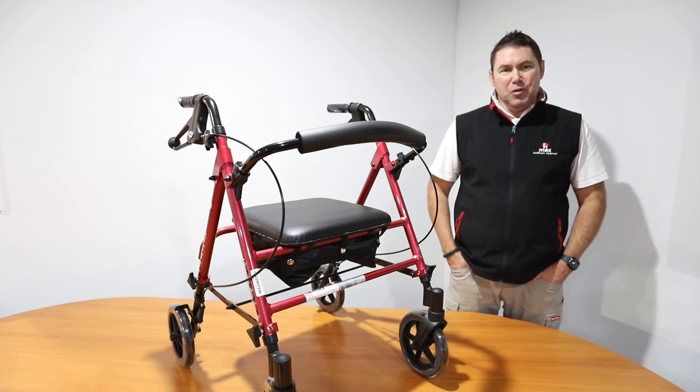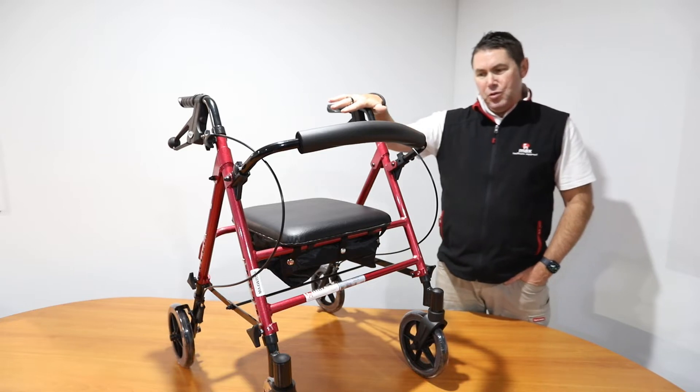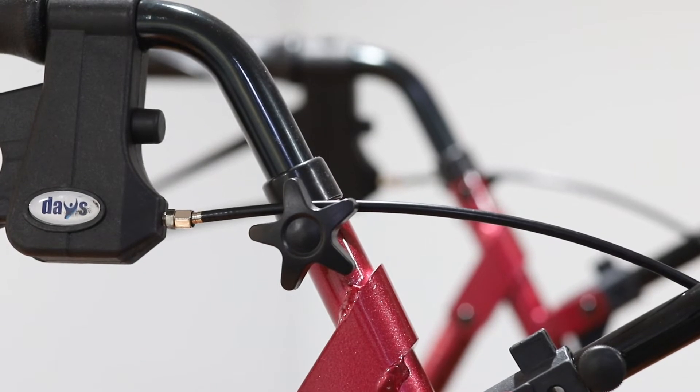Hi, I'm Andrew from Max Health Care Equipment. I have here with me today the Day's height adjustable four-wheel walker. This walker is a little different from most in that we can adjust not just the handle height, but we can also adjust the seat height.